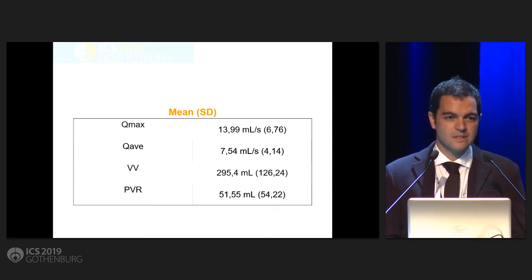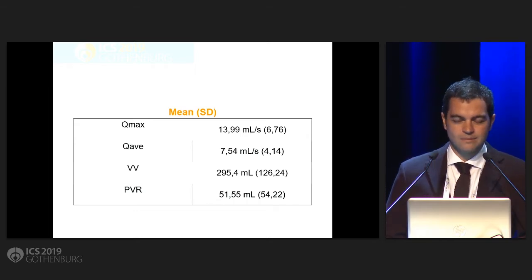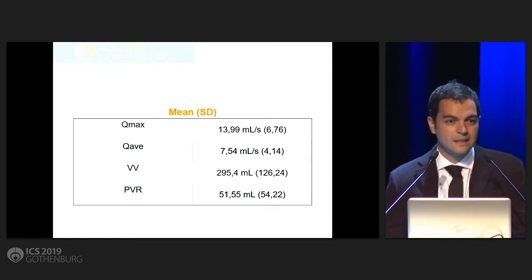Yeah, it would be really interesting to compare this with the voided volume or even the record, and compare it with that. And then the question is the clinical question. If I'm going to apply this one, and my patient scores C, does that patient get any treatment or not? I have a comment on it. To take this to make clinical decisions and indicate a surgery or any therapeutic management, I think we are not at that point now.